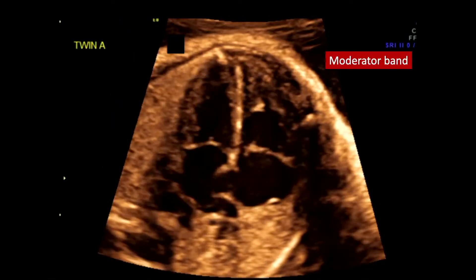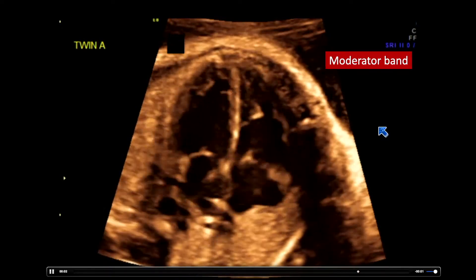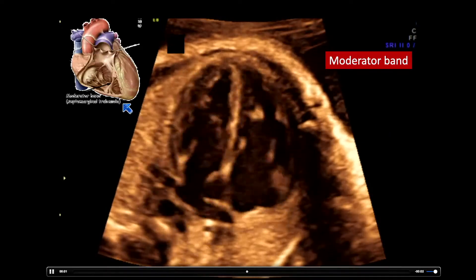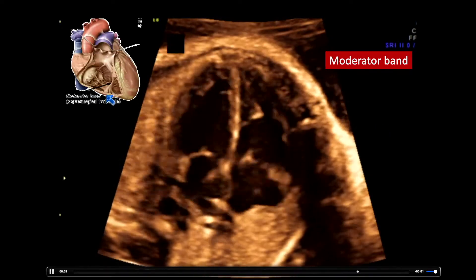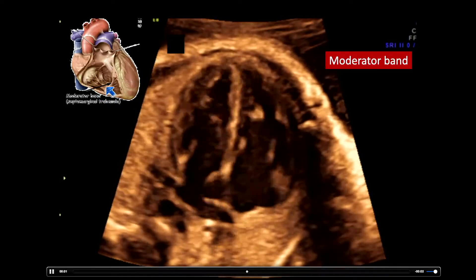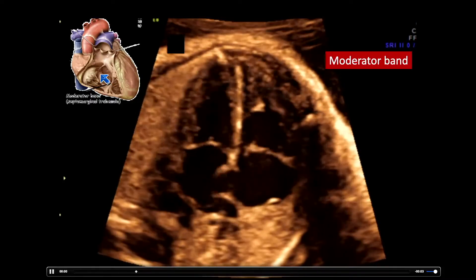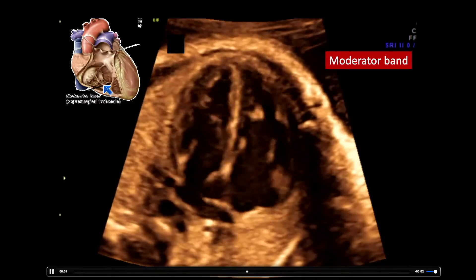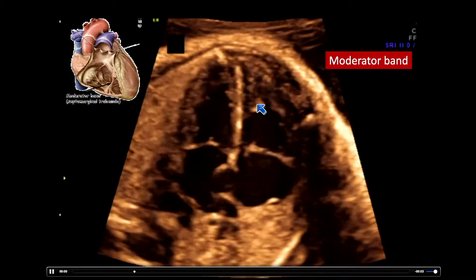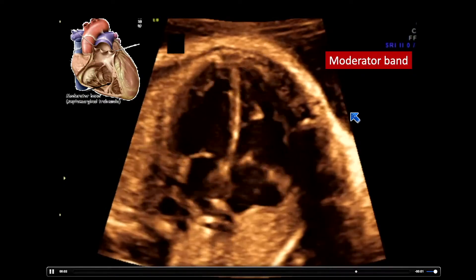The right ventricle is also going to be the ventricle that contains the moderator band. The moderator band is the septum marginal trabeculation where we have papillary muscle insertions, and it's always going to live in the apex of the right ventricle.